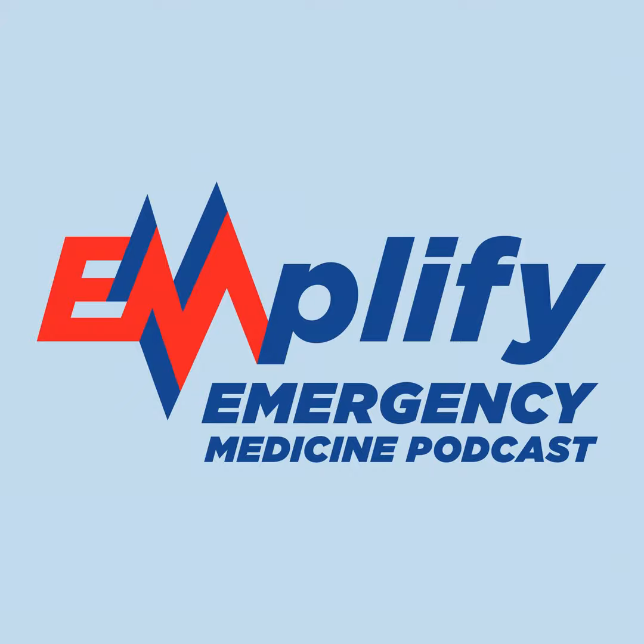Sure. So if you have someone with ARDS and despite high PEEP and maximal FiO2, they're still not oxygenating appropriately, in general, there would be two overarching strategies that you might use. One would be prone positioning. So if you can prone position the patient, that's relatively difficult in our ED setting often, although now because of COVID, people actually do pretty well prone with COVID. And so emergency departments are unfortunately becoming more and more facile with proning people.